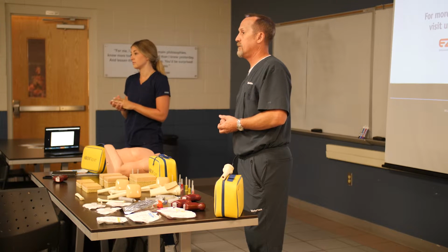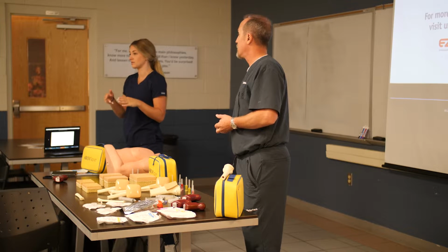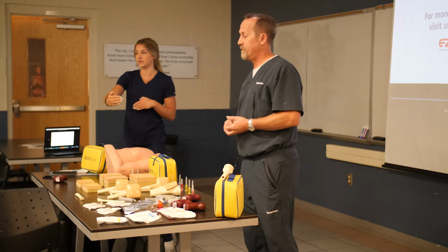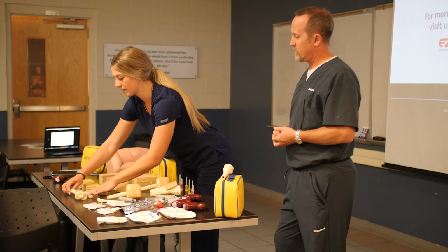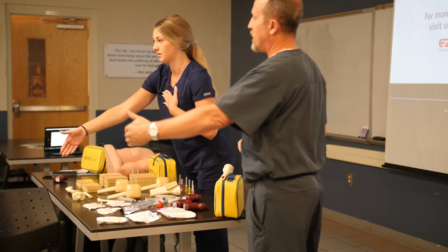Good question. Some people, we found at a cadaver lab last week as well, found it to be easier placing when they were on the opposite side of the table from the leg they were placing in, if that makes sense. So if my patient was laying here, with their two legs, I would place in the leg that's not closest to me.